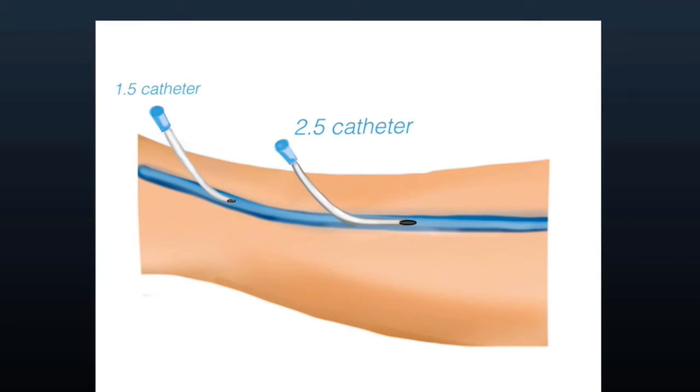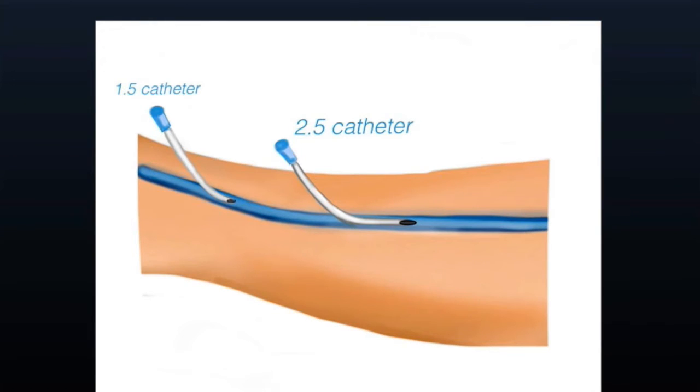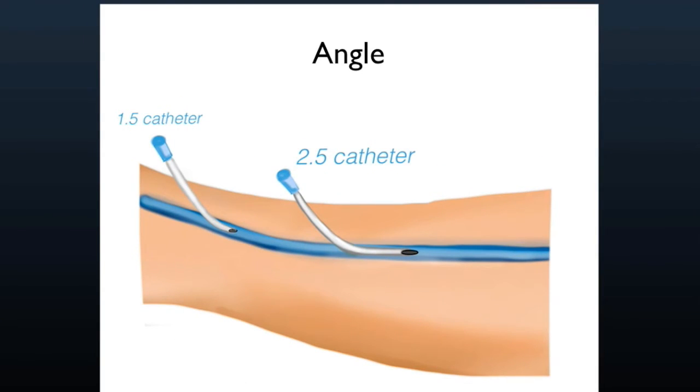The reason for this is even if you do get a 1.5 inch catheter in ultrasound guided, you can see here that just the tip is in. You have to go through more subcutaneous tissue, and so even if you get in and are able to cannulate it, this tiny tip in here is going to pull out as soon as they move their arm or do something else. Whereas if you have a nice long 2.5 inch catheter, you've got a fair amount of catheter in the vein. They last longer.